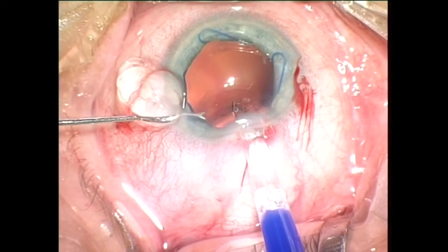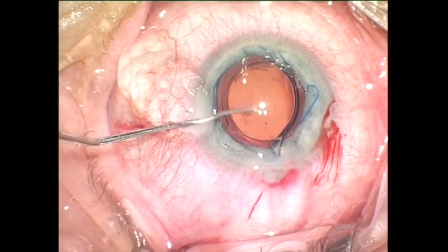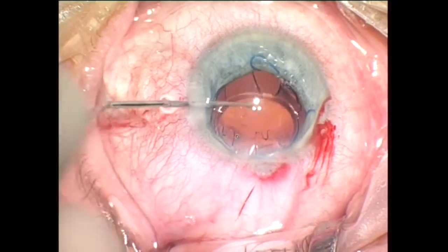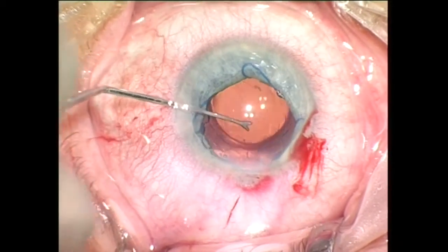A hydrophilic acrylic IOL is implanted through the unenlarged 2.0 mm incision and the haptic elements are positioned inside the capsular bag with the help of the side port instrument.